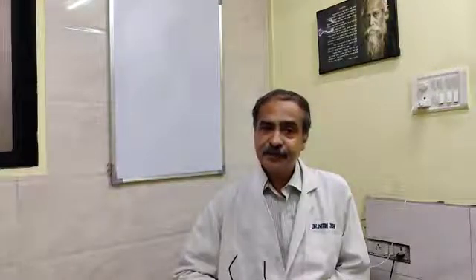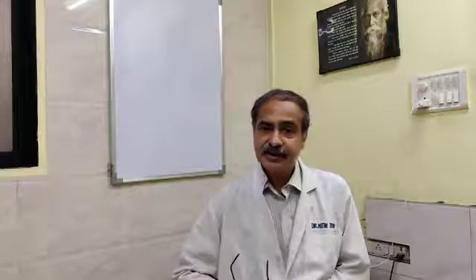Due to absorption of this irrigation fluid from the paraprostatic and paravesical space, there is a chance of development of immediate or delayed TUR syndrome. Secondly, just outside the prostatic surgical capsule there are venous sinuses which are extremely thin-walled, wide, voluminous, low-pressure systems. So there is a chance of injury to these venous sinuses because of prostatic capsular perforation.